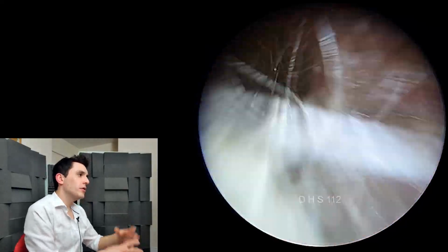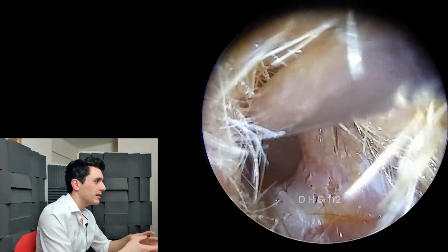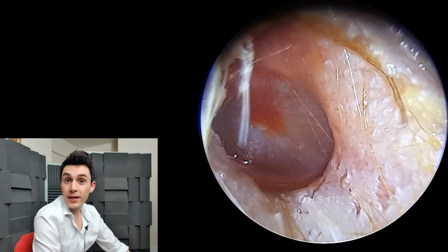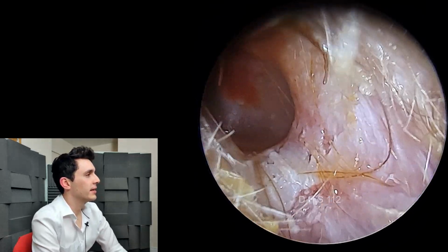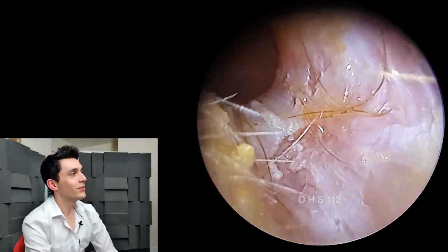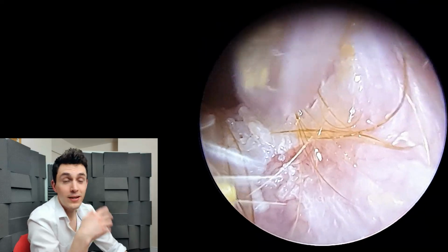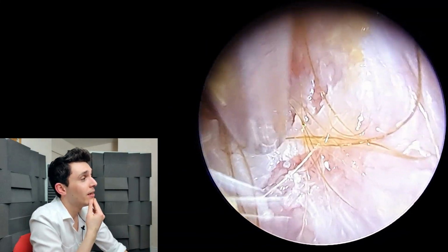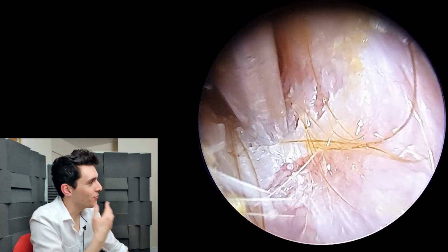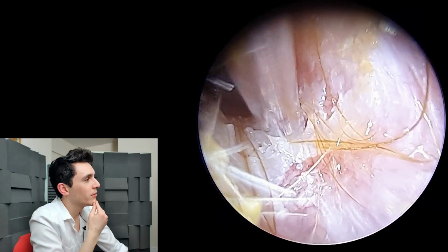I wanted to show this because it perhaps shows an approach and a technique that I've not really shown before on the channel. Just going the extra mile a little bit to clear away this dead skin. But desperate times call for desperate measures, really, because I just wanted to help the patient out, because I know for a fact, just due to how he is, he wouldn't even contemplate going to his local doctor unless he was dying.